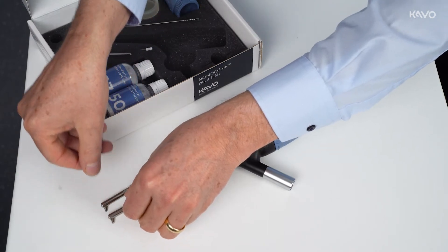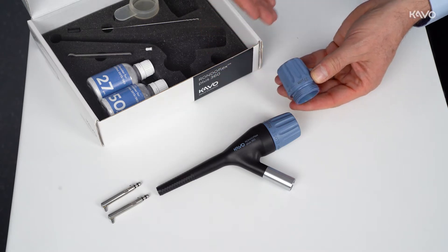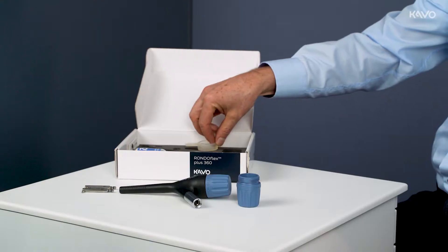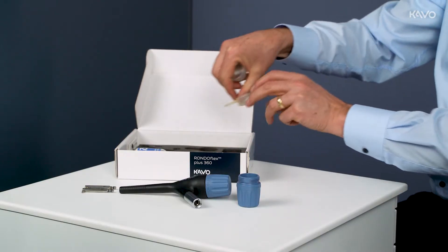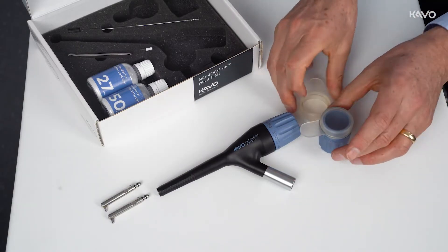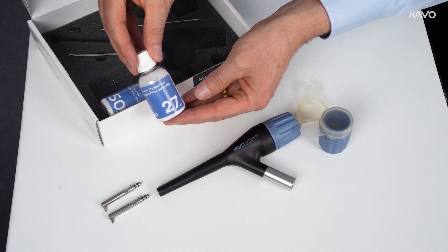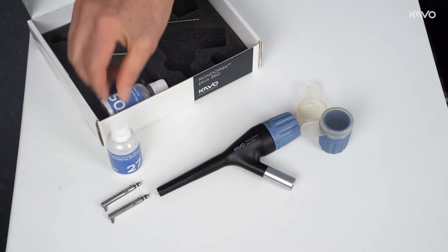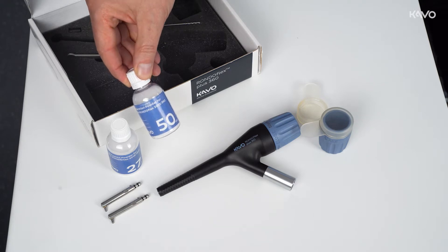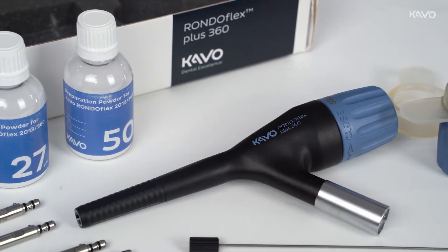Two powder containers with different labels are also included. This labeling ensures that the two available RONDOFLEX powders with a grain size of 27µ and 50µ can be closed with a lid and differentiated after preparation. The RONDOFLEX powder with a grain size of 27µ is intended for fine and softer surfaces such as composites or deep applications, while the powder with a grain size of 50µ is used for harder surfaces such as metal and ceramics, or for larger surfaces.